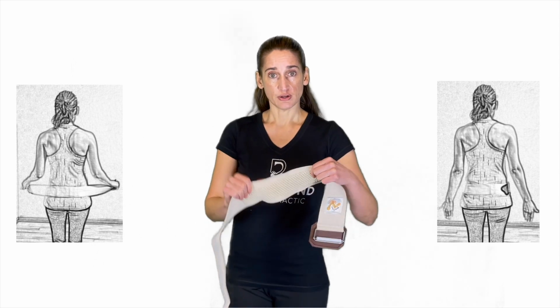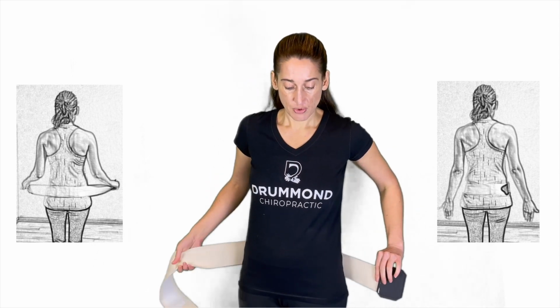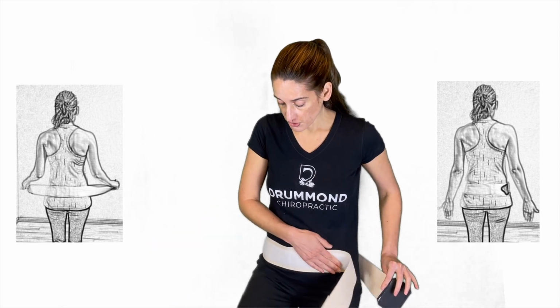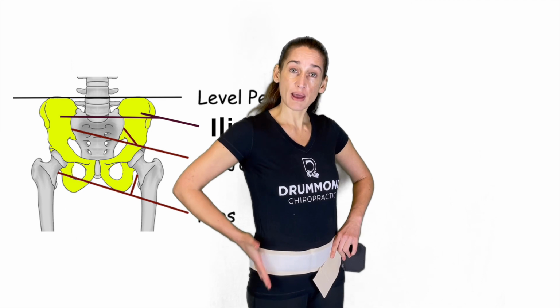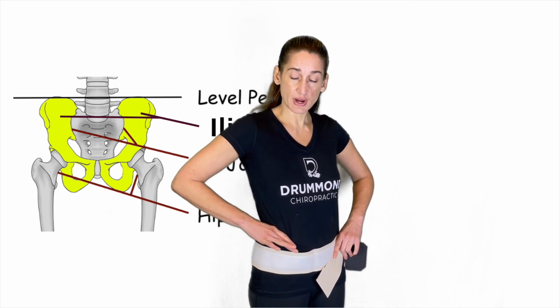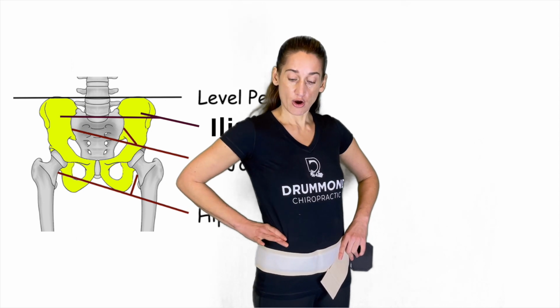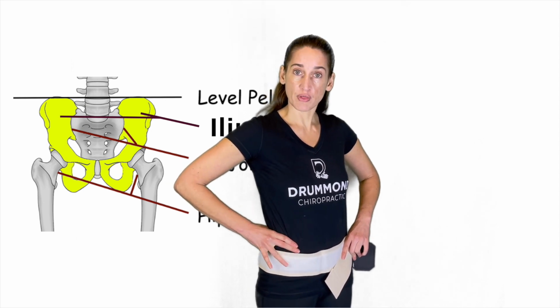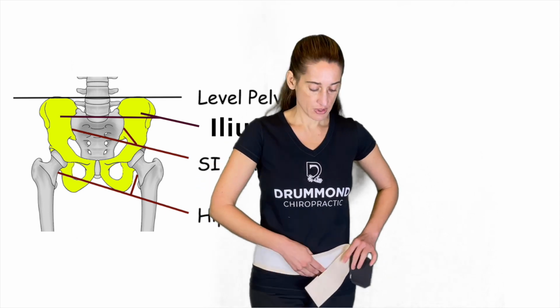So to put it on, you put it around you. Again, the sticky stuff is towards you. You want to make sure that it is above where your hips bend, but below where your flat bones are. You can put your hands on what people call the hip, even though your hips are down here, that hard bone you can feel. Make sure the belt is below that, and again, not in the way of your walking motions.